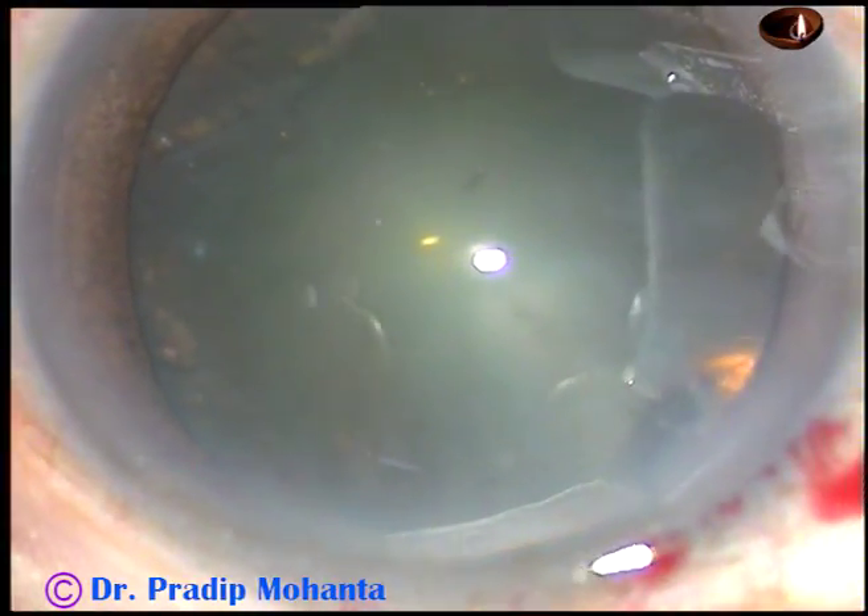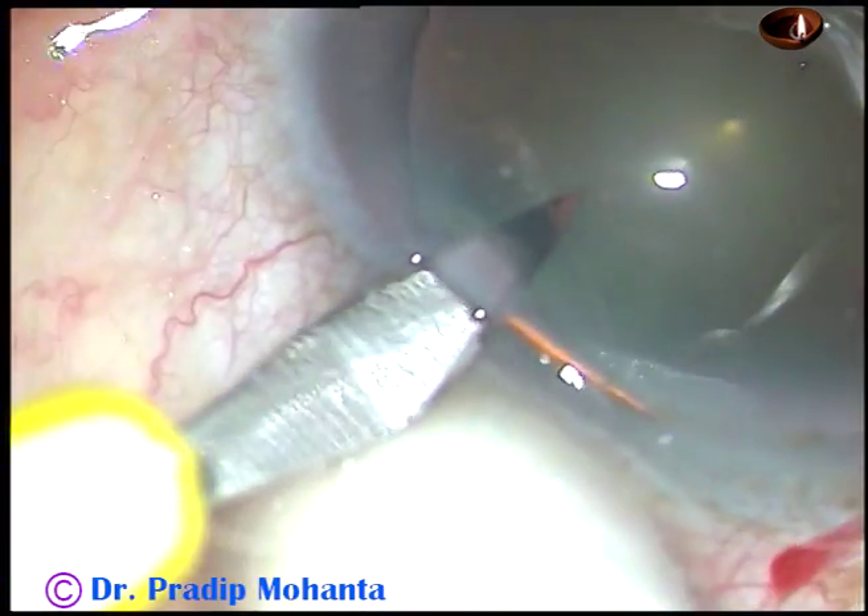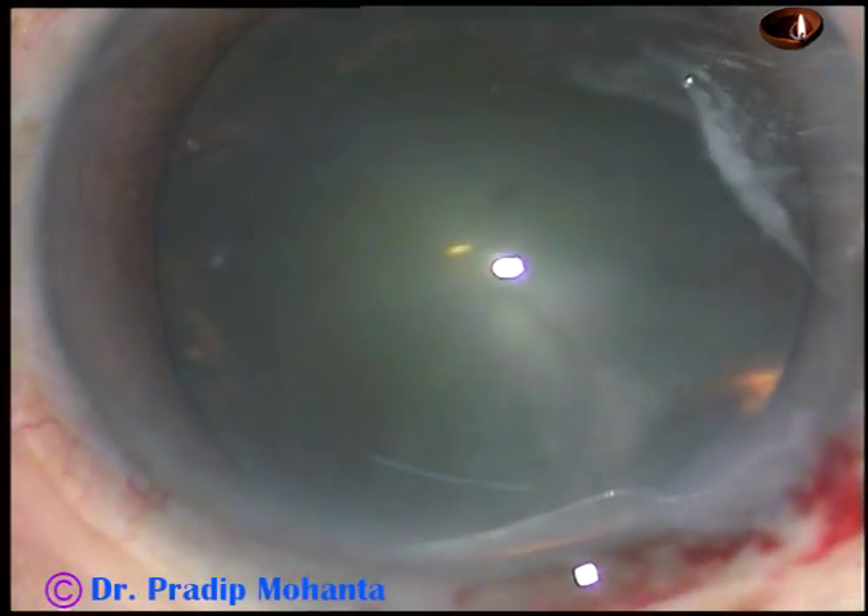One side port — only one side port is being made in this case, on the left side of the main incision.